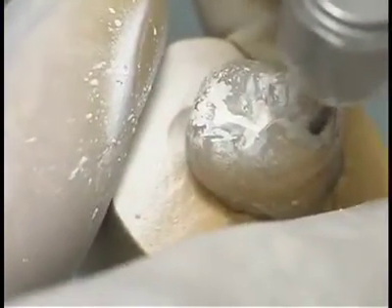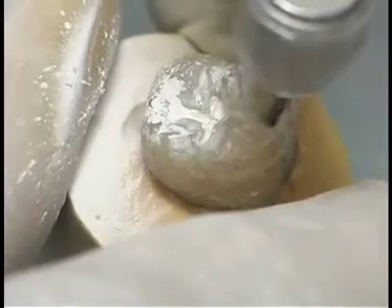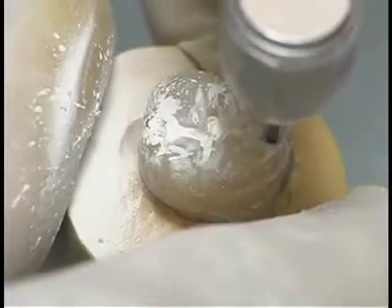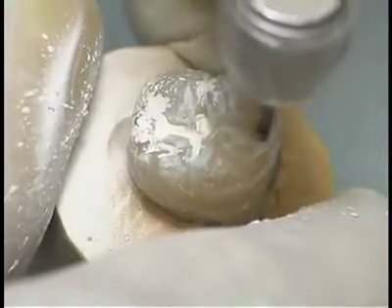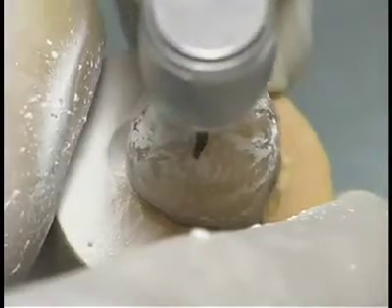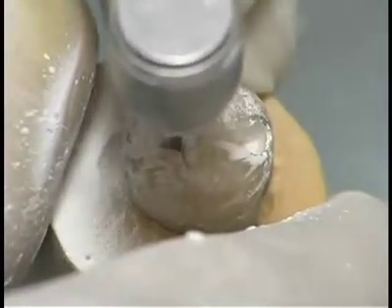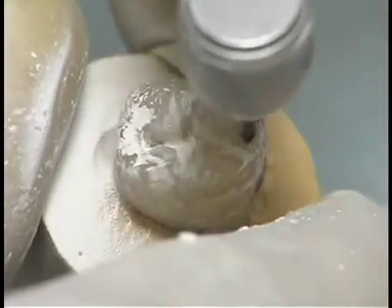The proper depth of 0.5 mm into dentin should be established. With intermittent pressure and continuous movement from one point to another following the DEJ, continue to maintain the burr's orientation and depth. Ideally, the width of the isthmus should be just wider than the diameter of the burr. The orientation of the burr should change to satisfy the direction of the different occlusal walls of the cavity.